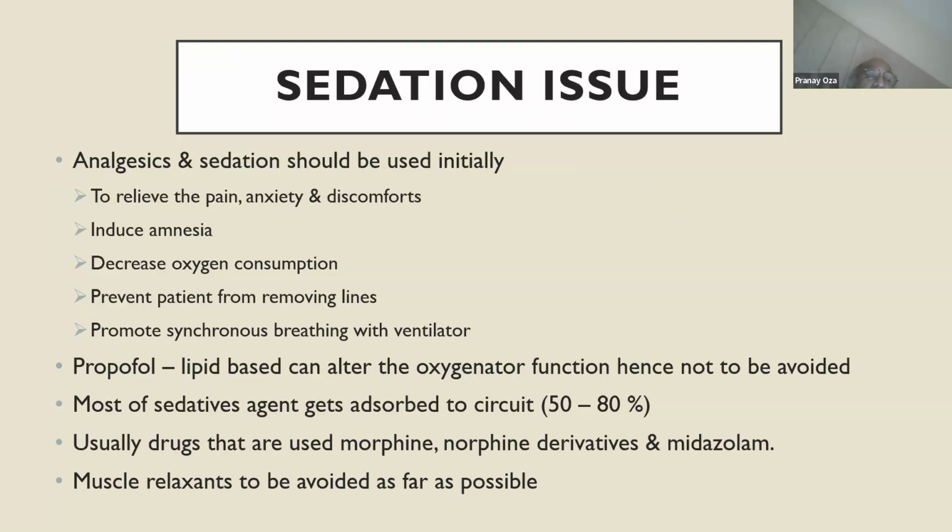Sedation issues, we prefer to get the sedation down after 48 hours, try to make the patient awake. No muscle relaxation to be used, especially when you are trying to wean the patient from the ECMO, so at that time don't use it at all.